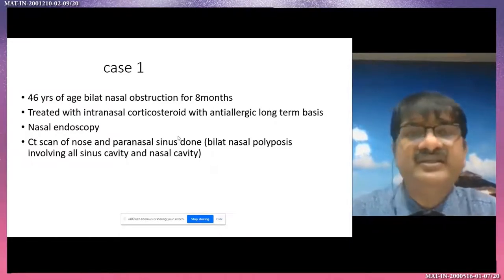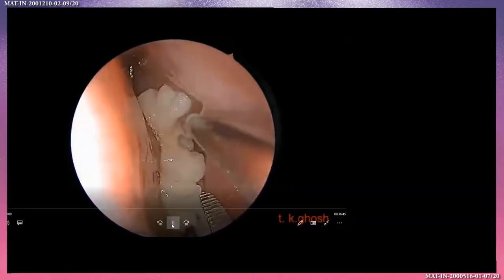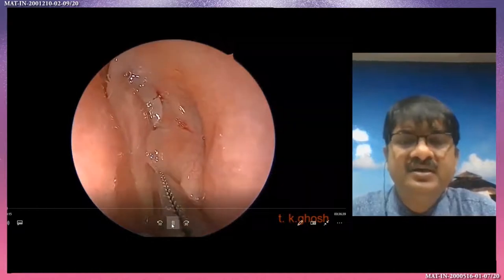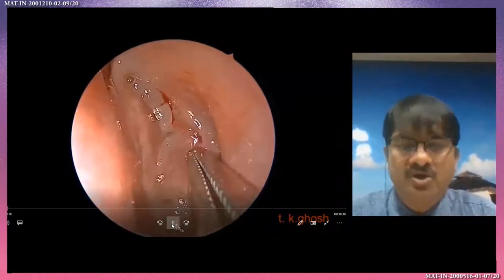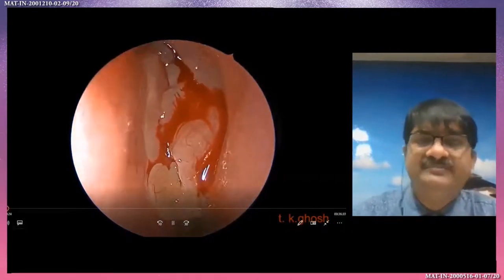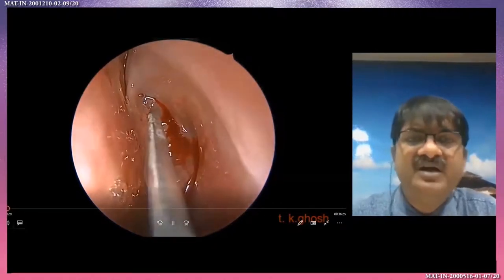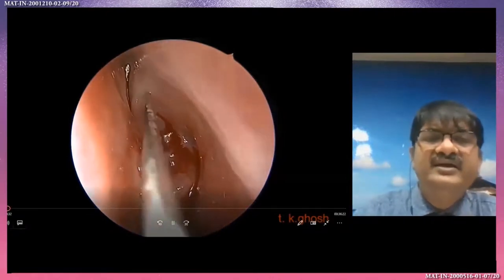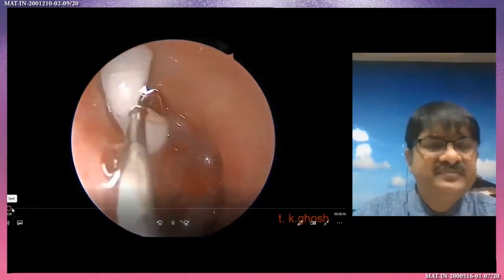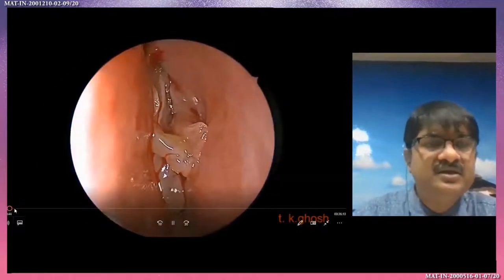Now I will show the surgery. Just before starting the surgery, you should definitely pack with gauze or cotton soaked with adrenaline to delineate the structure and to reduce bleeding. Some surgeons prefer injection with adrenaline, some don't — I prefer the injection in the axilla region. This is very important. After that, just wait for five to ten minutes and then start the surgery.